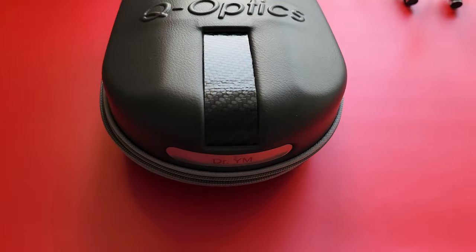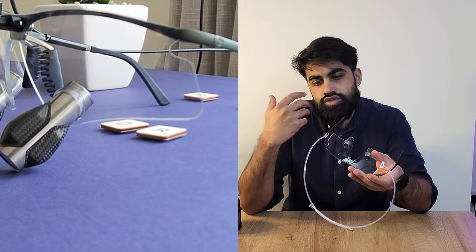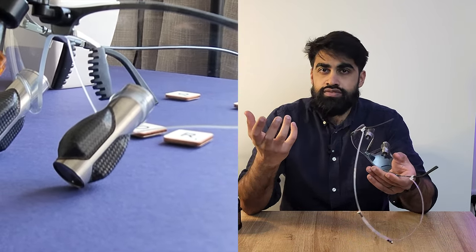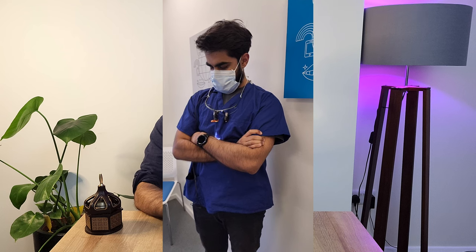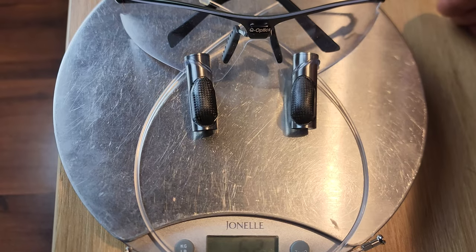I went for the Eclipse loupe, which isn't the trendiest frame — they do look like safety goggles — but I wanted the most comfortable option. As I've got older I've realized I prefer comfort over fashion, especially when wearing them for several hours a day. I was really impressed — they are super light, surprisingly so. I did not expect a prismatic loupe to be this light. Comparing them to my Oroscopic Eye Zooms, they are significantly lighter.